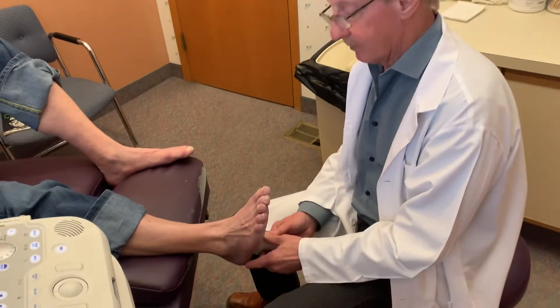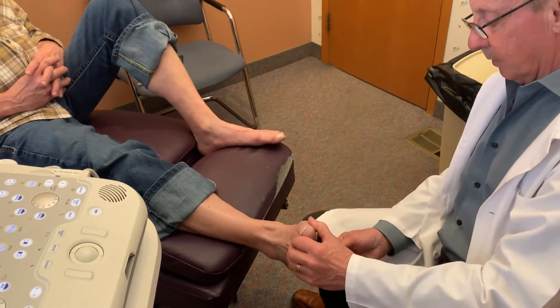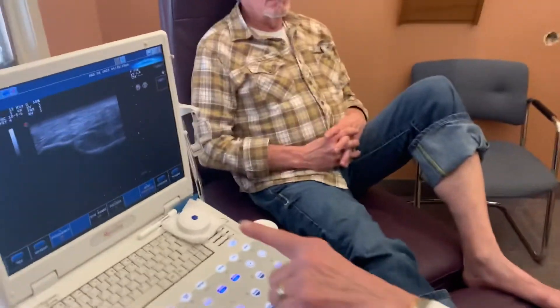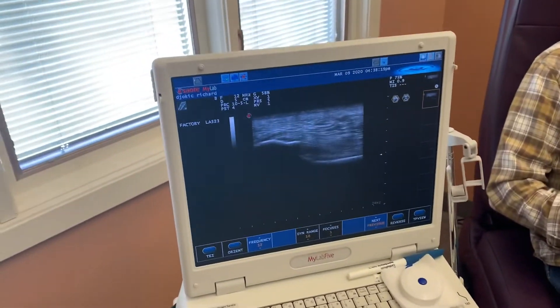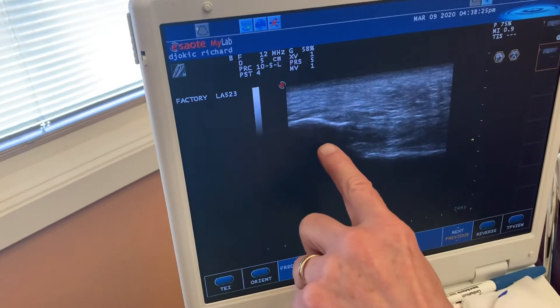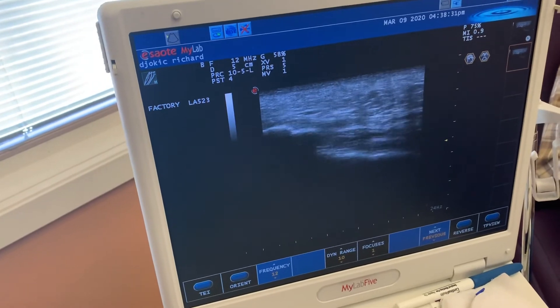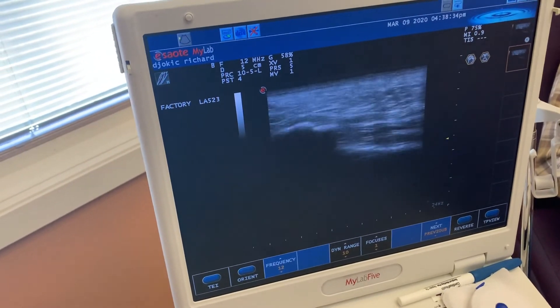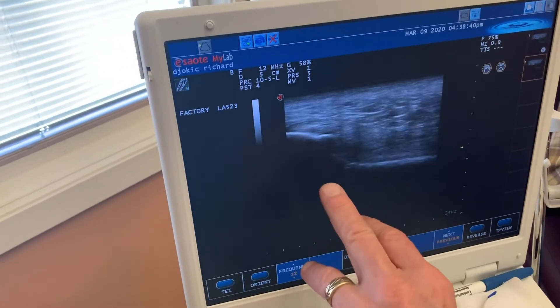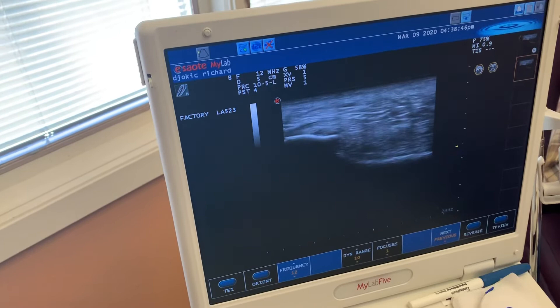So we're looking to see what he has here. What I'm doing is I'm just placing this ultrasound at the bottom of the heel. And then if we scan over to the monitor — right here you can kind of see that really white area, that's the bone, the heel bone. And right in there is the fascia. This would be going out towards your toes. When I'm pushing on that, you can kind of see the bone and the fascia move as one unit up and down.